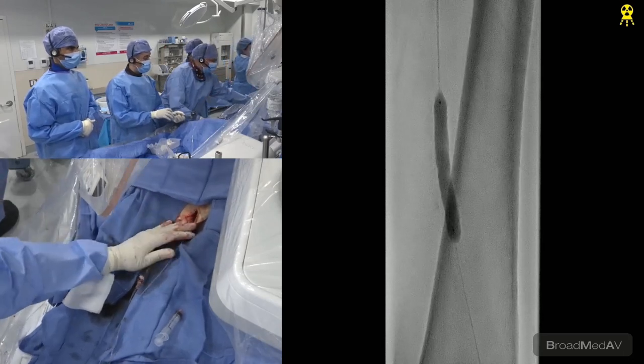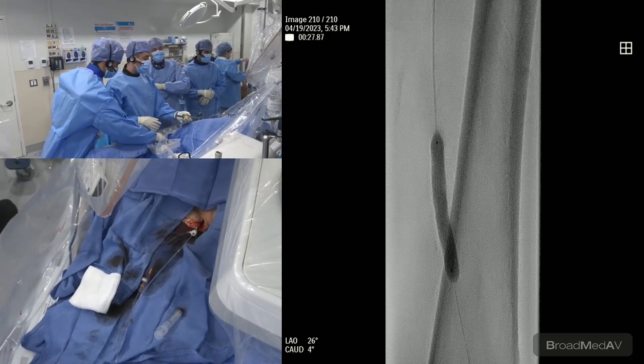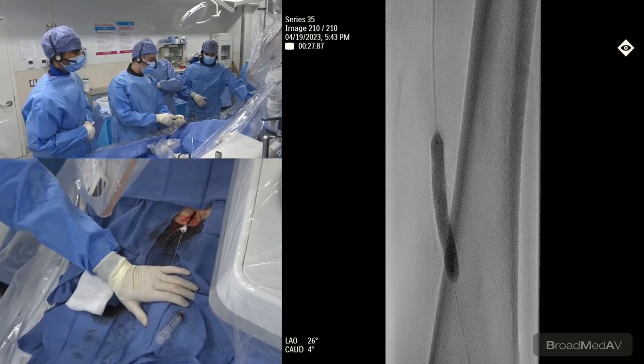And we're seeing now that this 7.0 balloon is looking 6. Okay, a little bit of pain here. You're doing great, my friend. So it's a large balloon, which we know because we want to put a larger Supera.